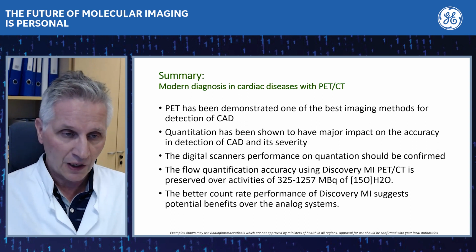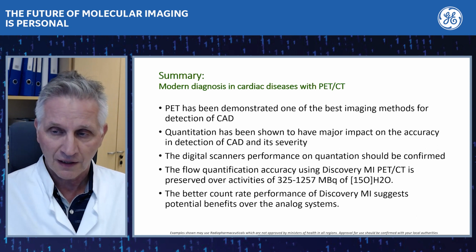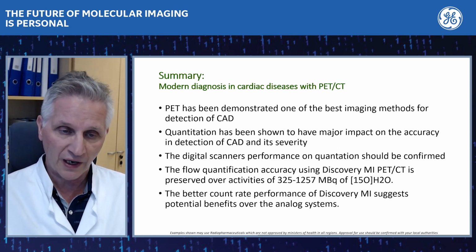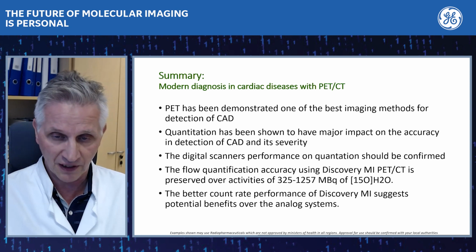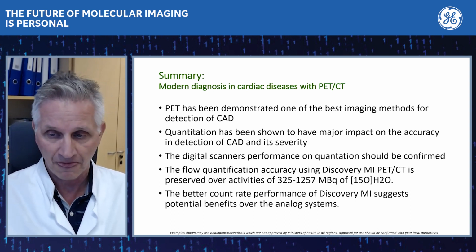And when we look at the flow quantification accuracy using Discovery MI PET-CT, we found it's very well preserved over activities at least from 300 to 1200 megabecquerels of radio water.